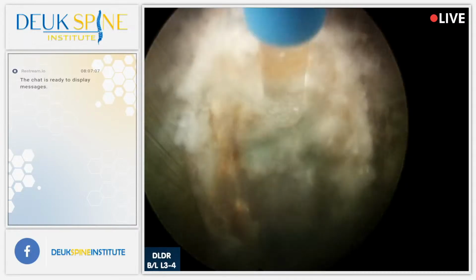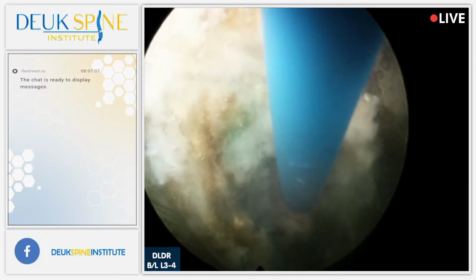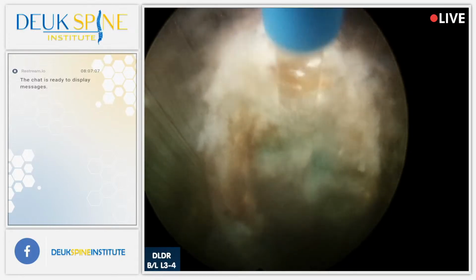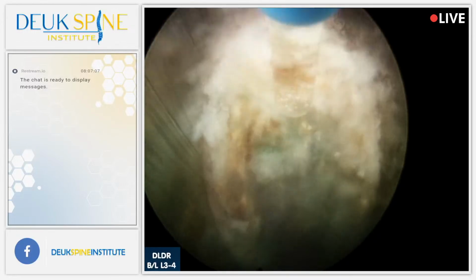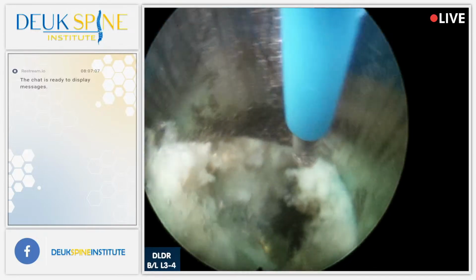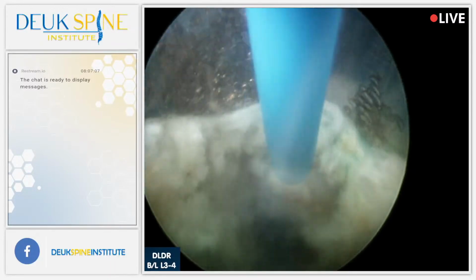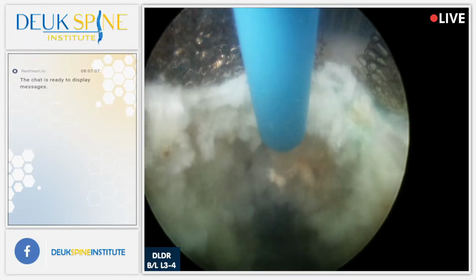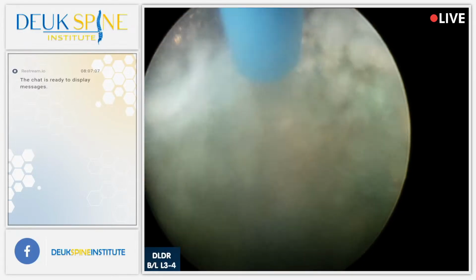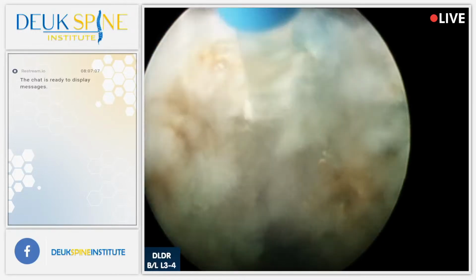Jordan, have you been keeping track of the amount of radiation? You're going to start. Okay. Yeah, because I know we've kept track of it for the fusions in the past. All right, so the amount of radiation exposure you're going to get for a fusion surgery is around 3 minutes to 5 minutes. But with the Duke laser disc repair, it's around 5 seconds of radiation exposure. So far less. But there is a small amount because we are using a fluoro machine, which is an X-ray machine. Produces X-rays.